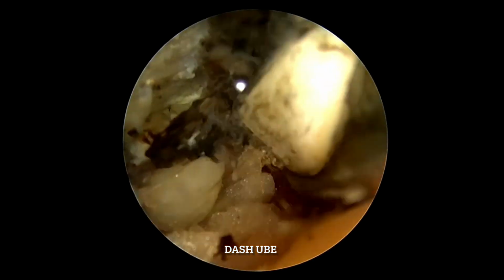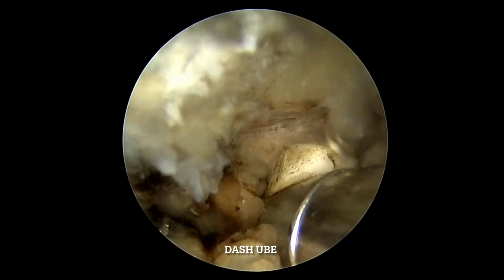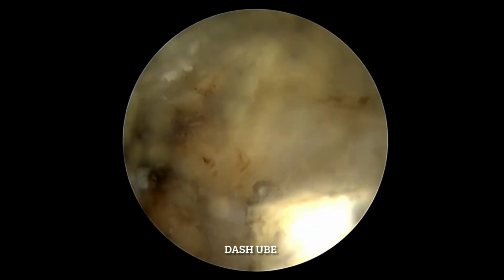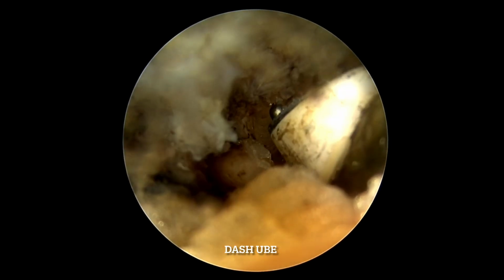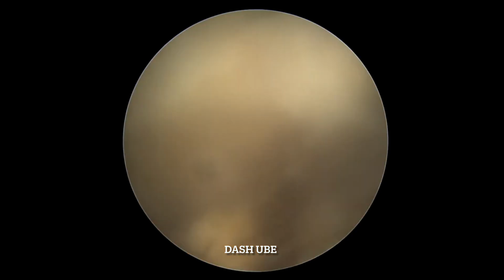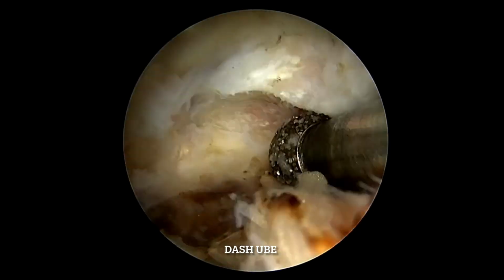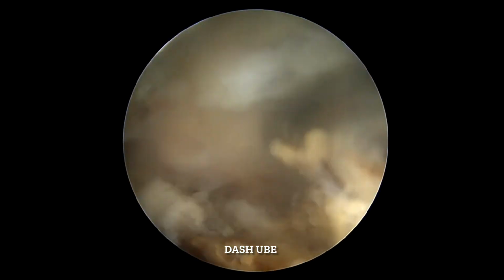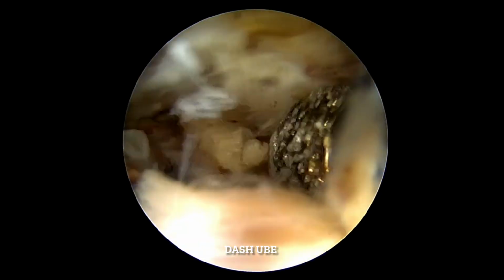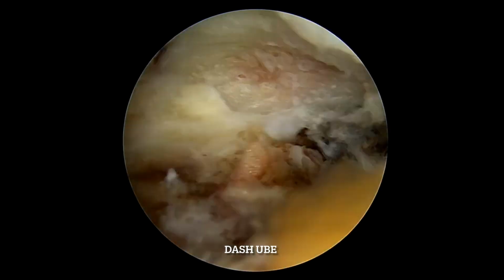First you work on the IAP, then you move to the SAP. The SAP is seated deeper, so the joint capsule will guide you most of the time for the limits of the joint. Now, drilling with a diamond drill is very handy in these cases to make space and widen this foramen. At the 9 o'clock position, you can see the foramen.